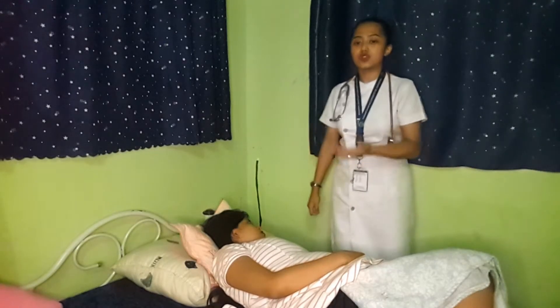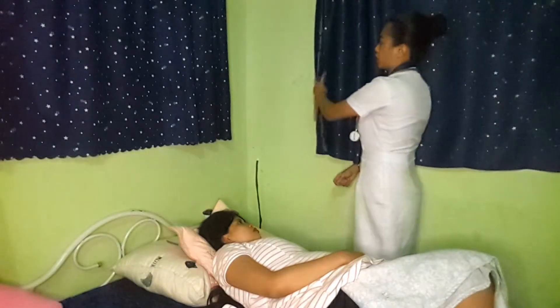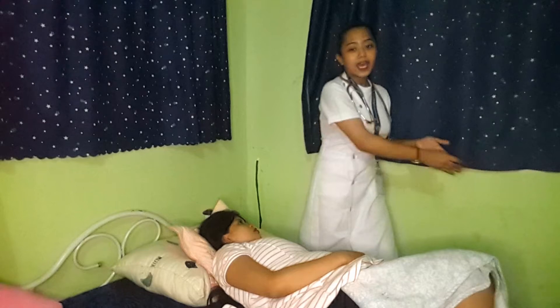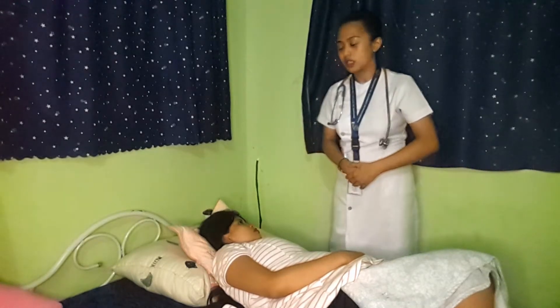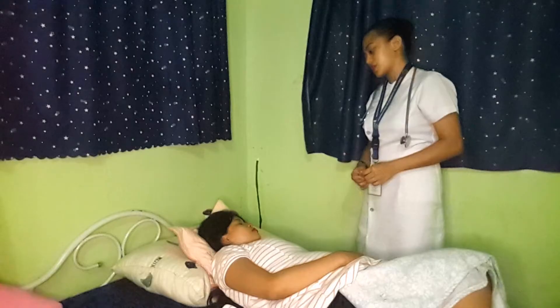Let's go now to the implementation proper. We need first to provide privacy — if there are curtains, we need to ensure that they are closed. We need to wash our hands. The next is we need to introduce ourselves to the patient. Good day, ma'am. I am Rizekiel Madison-Cantilio, and I will be your nurse for today.